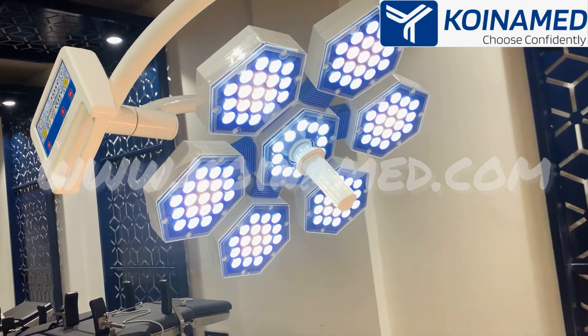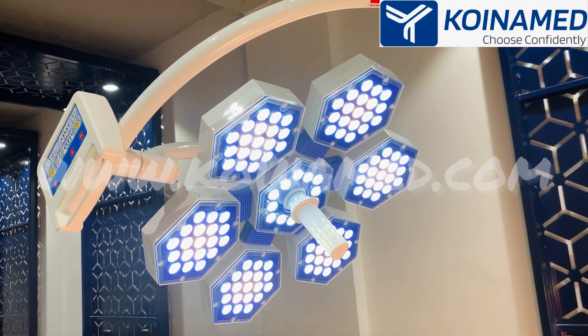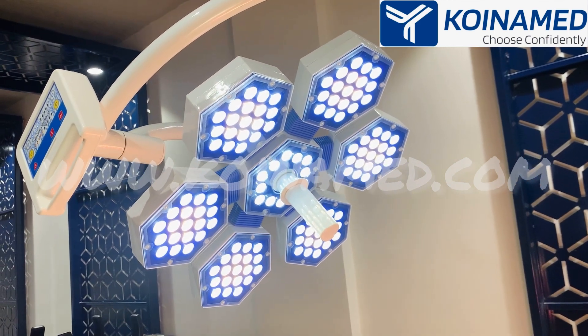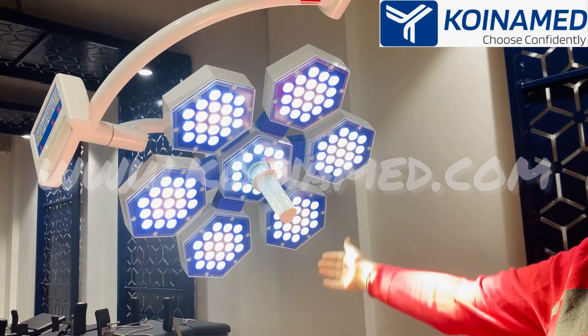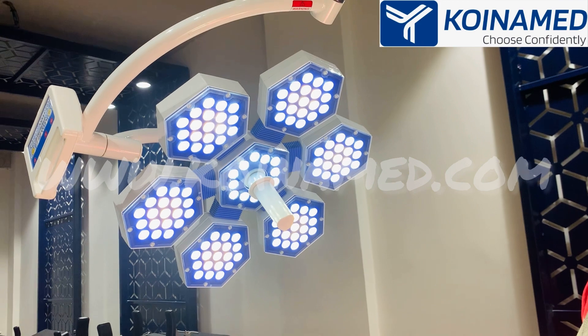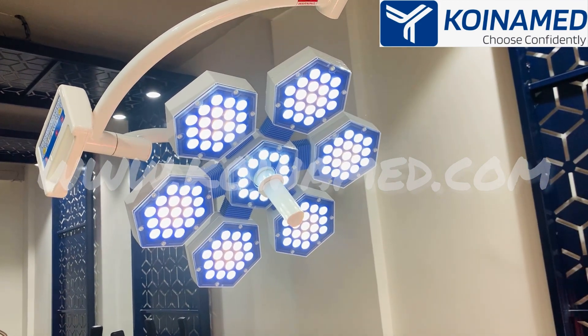We have provided a combination of white and yellow LEDs, and these LEDs are from Osram, made in Germany. The diameter of the light is 500 mm and the size of the light field is 12 to 30 centimeters.